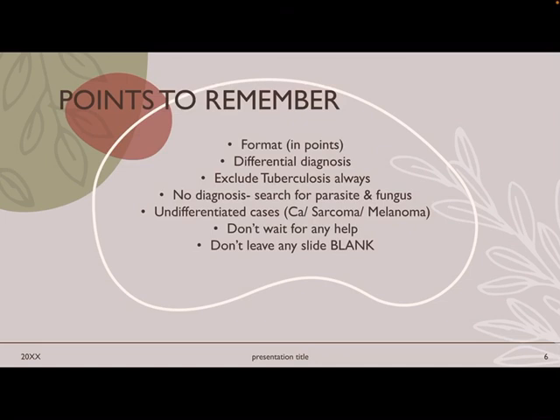Try to come to a diagnosis, but always put a differential diagnosis, because there is sometimes very little chance that you get the exact diagnosis you are clinched onto, because there are so many lesions that look alike. So if you're really confident, you can write the diagnosis, but still I would say after your diagnosis, write 2 to 3 differential diagnoses in case you get it wrong.